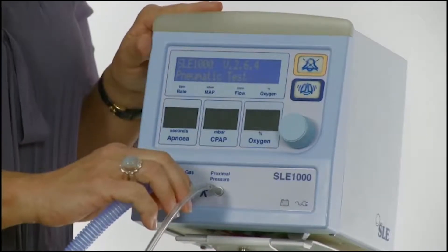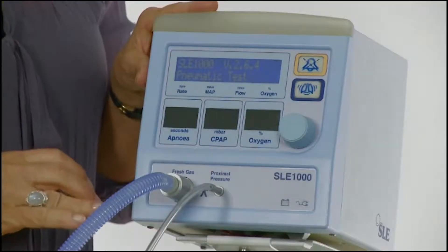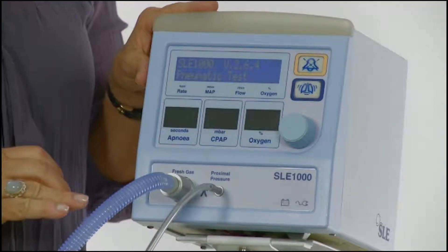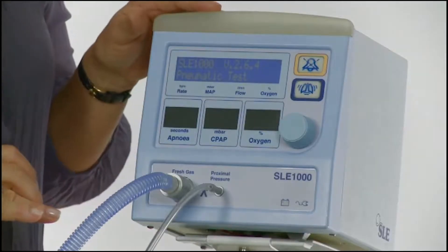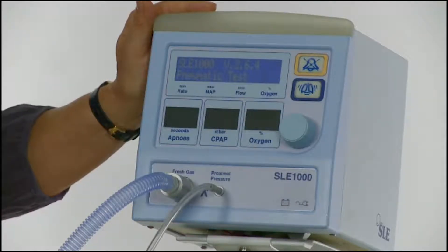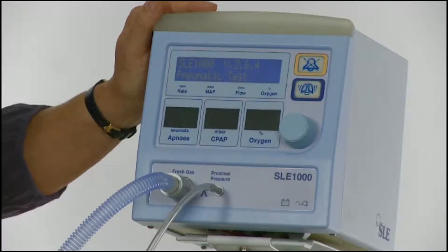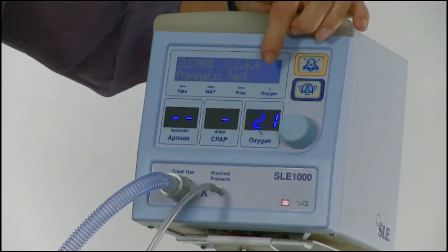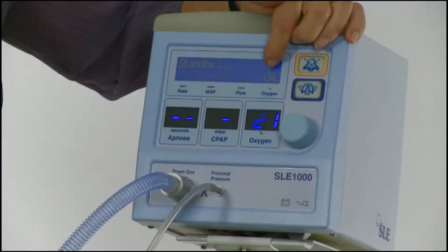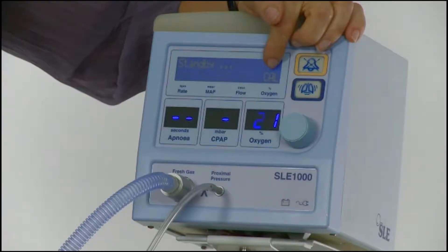The SLE-1000 then switches to standby mode while it completes the calibration of the oxygen monitoring system. The calibration will take approximately three minutes. In standby mode, the flow is reduced to two litres a minute. The 21% oxygen calibration begins and CAL in large letters will be displayed in the bottom right-hand corner of the LCD screen.